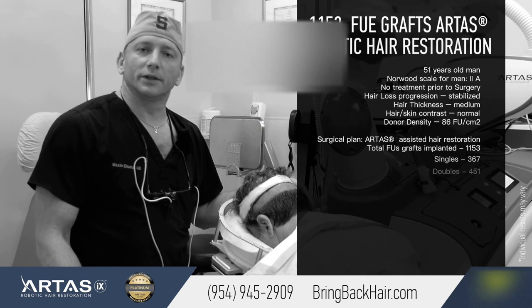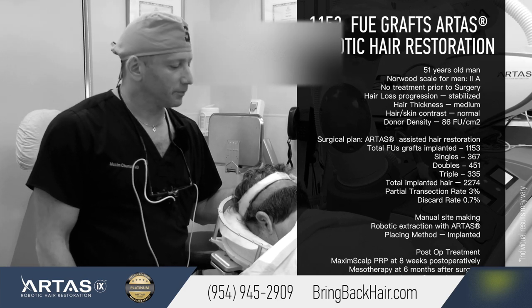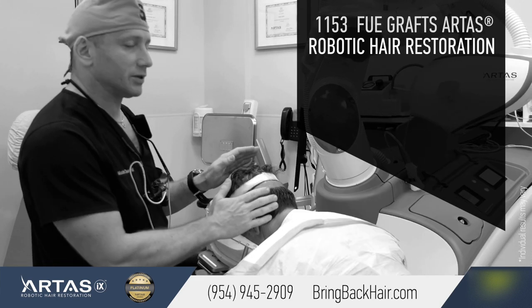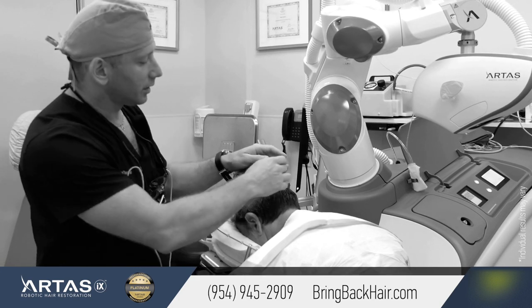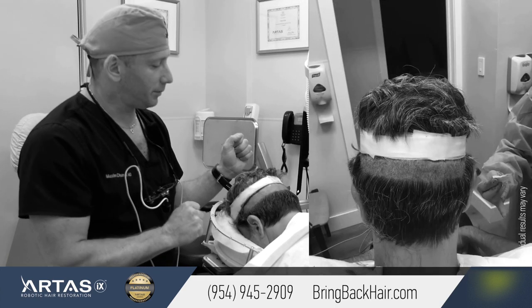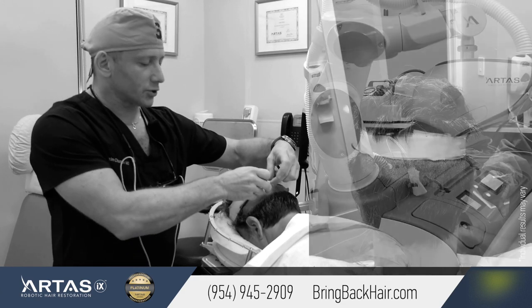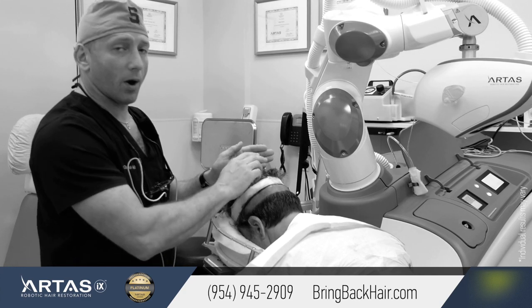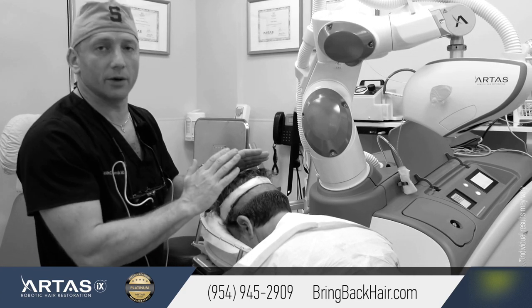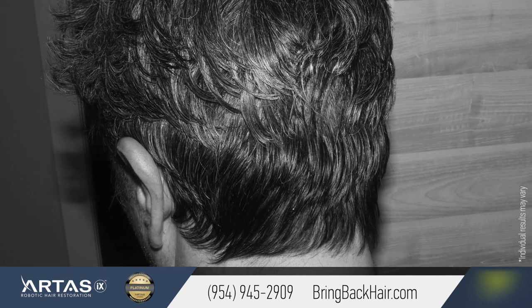We're here to begin the 1100-graft robotic hair restoration procedure. What we do differently today is utilize what we call a shaveless technique. We created a strip of trimmed hair to 1.2 millimeters, trimmed in a way so that the hair above it will cover the harvesting area once we're done. After the procedure, it won't be noticeable that our patient had anything done.